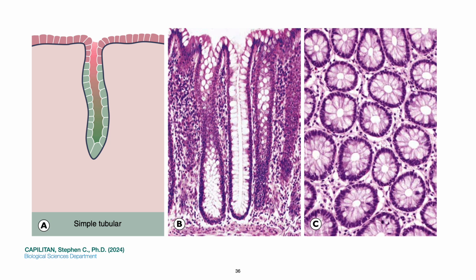These glands are shown in longitudinal section in the micrograph in letter B and in transverse section in letter C. They emphasize the regular arrangement of the glands and the large number of mucus-secreting goblet cells in the epithelium. At other sites, mucus is secreted by columnar cells that do not have the classic goblet shape but nonetheless function in a similar manner.